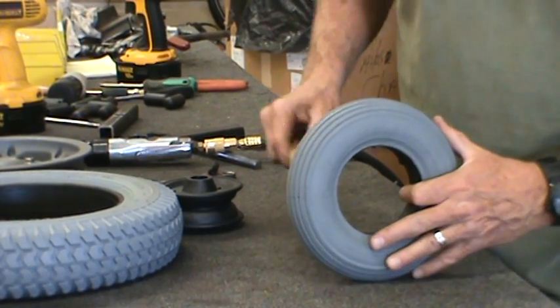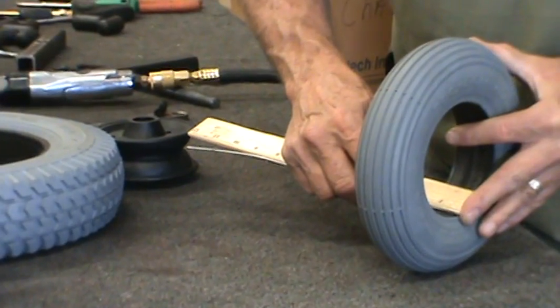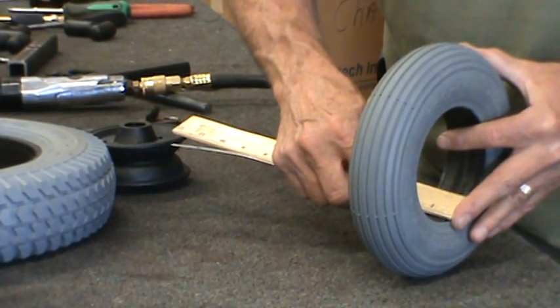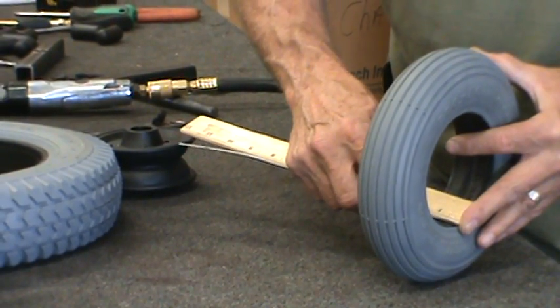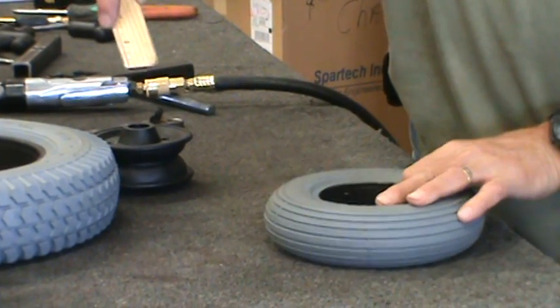Now in order to get the right foam fill you need to know the bead to bead width. You measure from outside a tire to outside a tire through the middle, and this one comes to about an inch and a half.